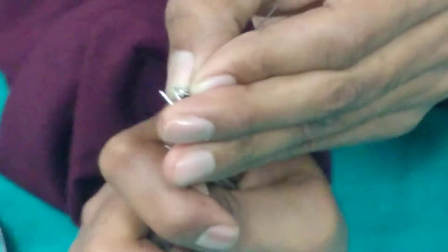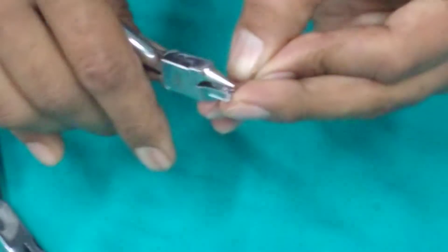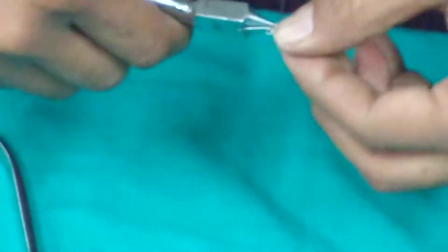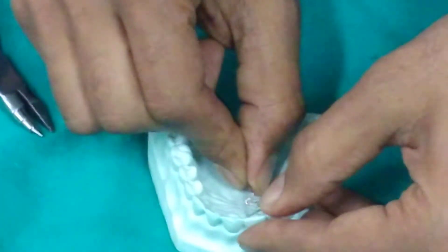The spring is always at 90 degrees to the tooth intended for movement. We are now giving a bend so that the Z spring is at 90 degrees to the long axis of the tooth intended for tooth movement.